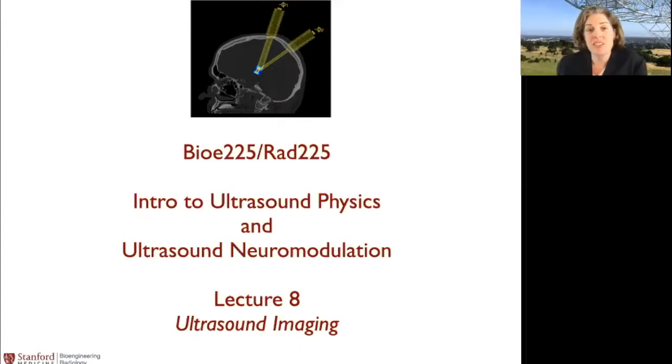It's a great question. All we really know is that when we are scanning the fetus, we are at power levels that are way below the threshold for any kind of damage. And so we'll talk about that in the next lecture. What are those thresholds for damage? But we're below those when we're scanning, and it's a very similar power level to what we're doing with neuromodulation. And so we don't really know. We could be stimulating the fetus.